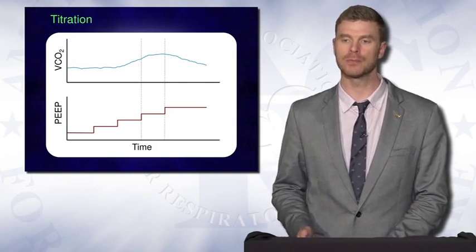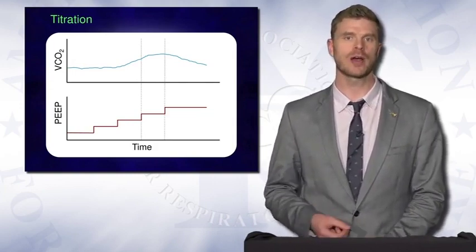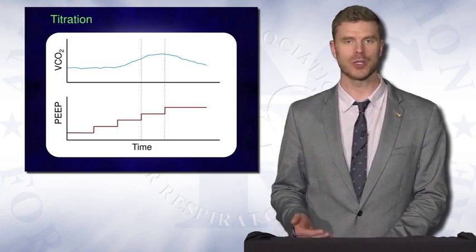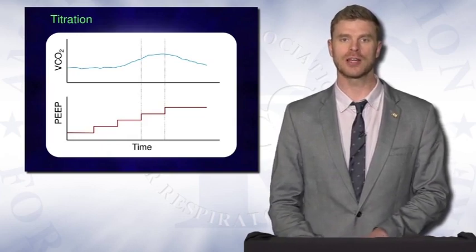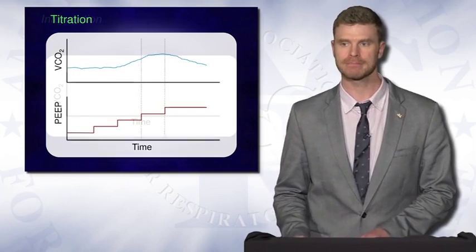decrease in VCO2. Important disclaimer: although the physiologic rationale for this procedure, looking at VCO2, I think is sound, there's essentially no data to support its use. So I urge you to use this with caution when applying these techniques at your bedside, and if you have the capacity to, please study it.